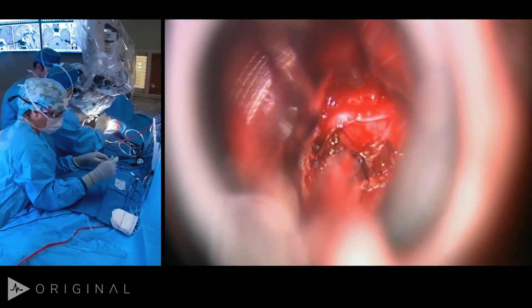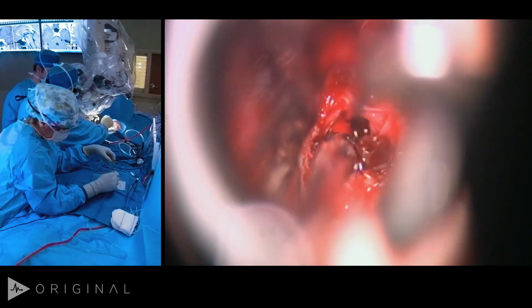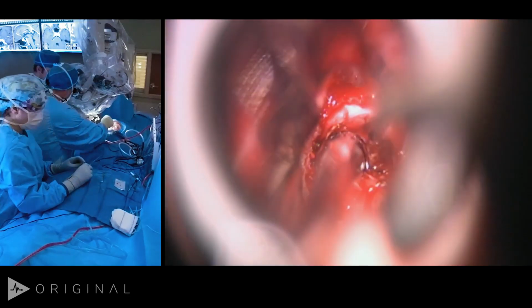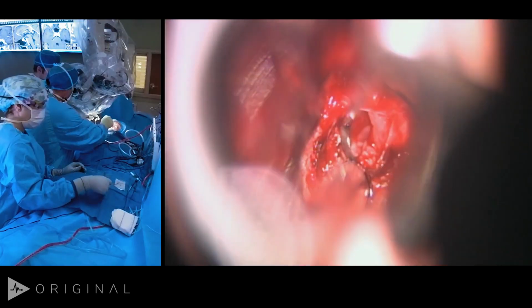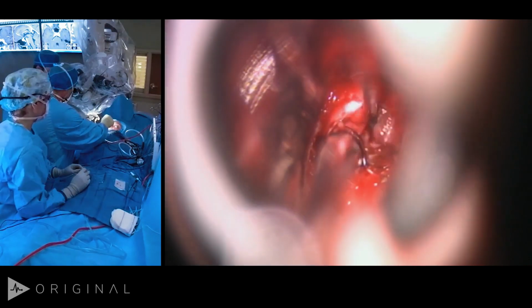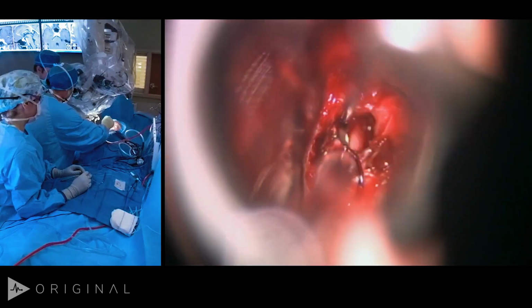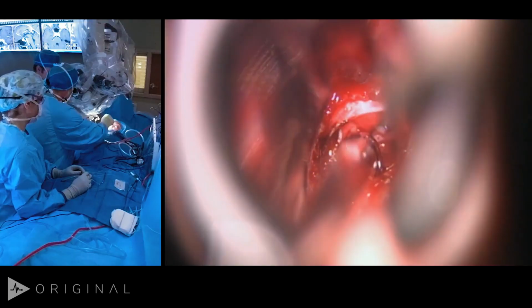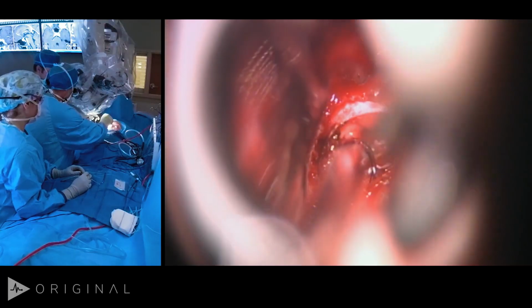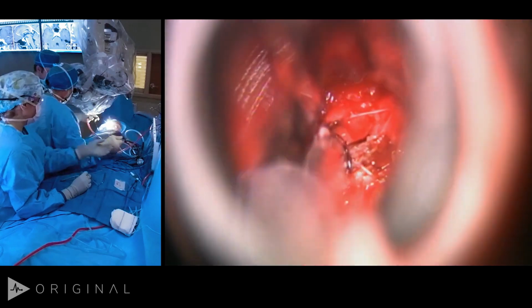You can see for yourself that when we open the dura, there's an obvious tumor on her right, but in fact, I found something over here, right? And that's not posterior gland. So that has to bother us, right? They have two tumors. I think this is probably that, quite frankly. There's the posterior gland way back there, whitish, bipolar. So that's a little distressing, actually.